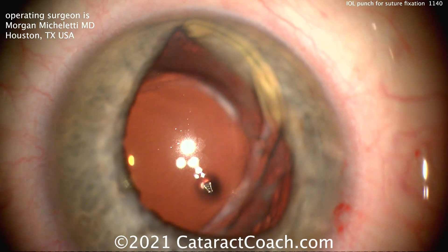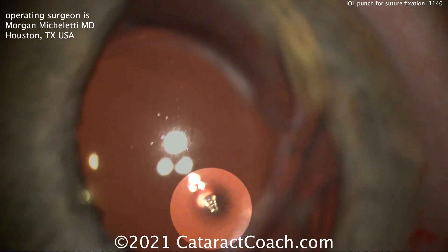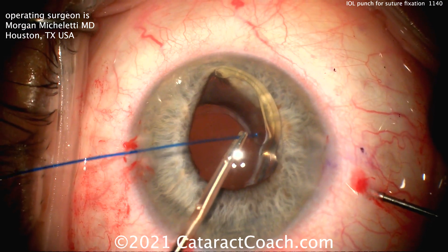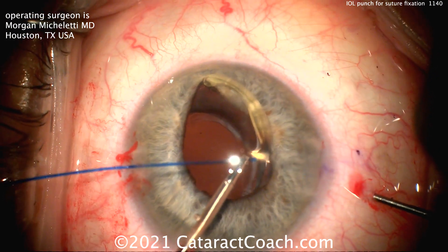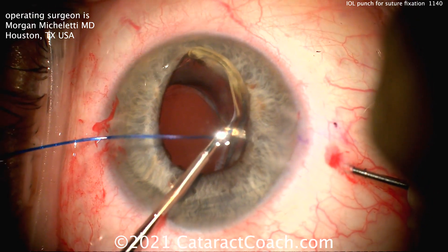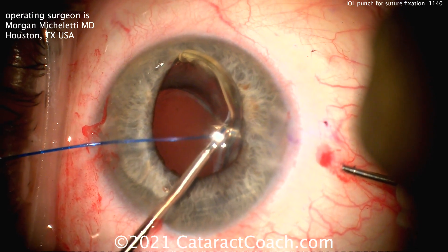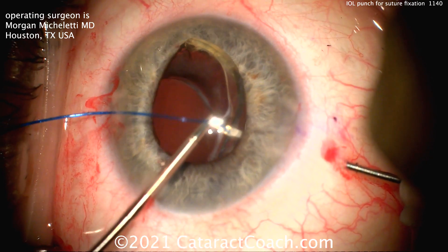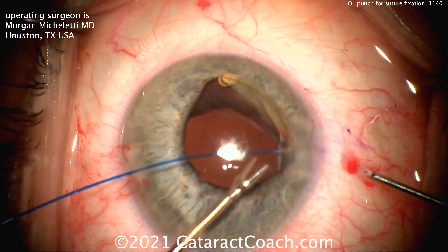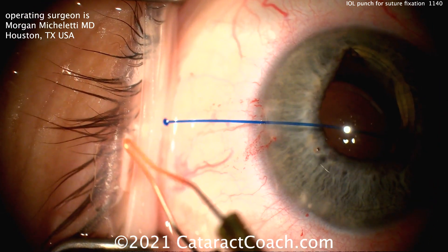Now, how to secure the lens — we've seen this technique before. There's the discarded piece of acrylic material. We can go inside the eye with a 5.0 or 6.0 Prolene suture, pass it through the hole just created at the haptic-optic junction, and using a needle on the other side — a 27-gauge or maybe even 30-gauge needle depending on your suture type — bring that suture out of the eye.